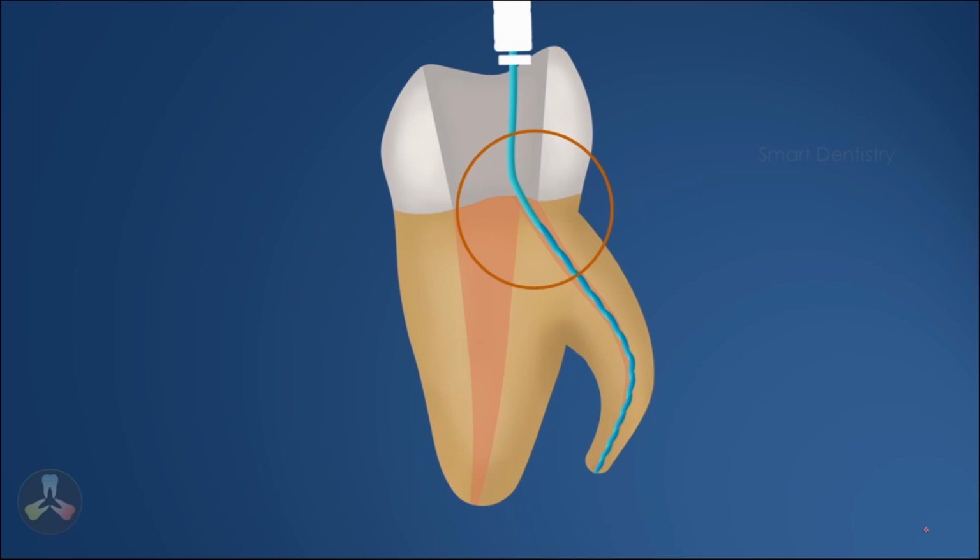If you continue to do cleaning and shaping at these curvatures, the chances for file breakage are too high. Doing a root canal treatment in the radix root without breaking the file is an art, because the chances for file breakage are too high. Even if it doesn't break at the canal orifice level, because of the double curvature, it can fracture. That is, the file can fracture even at the apical end, where there is also an acute curvature. So we have to be extremely careful while doing cleaning and shaping for a radix root.